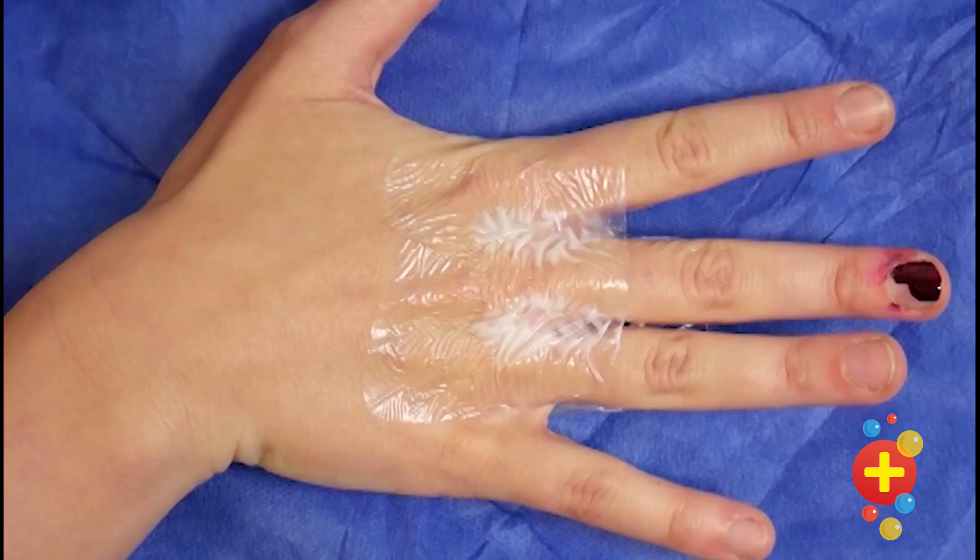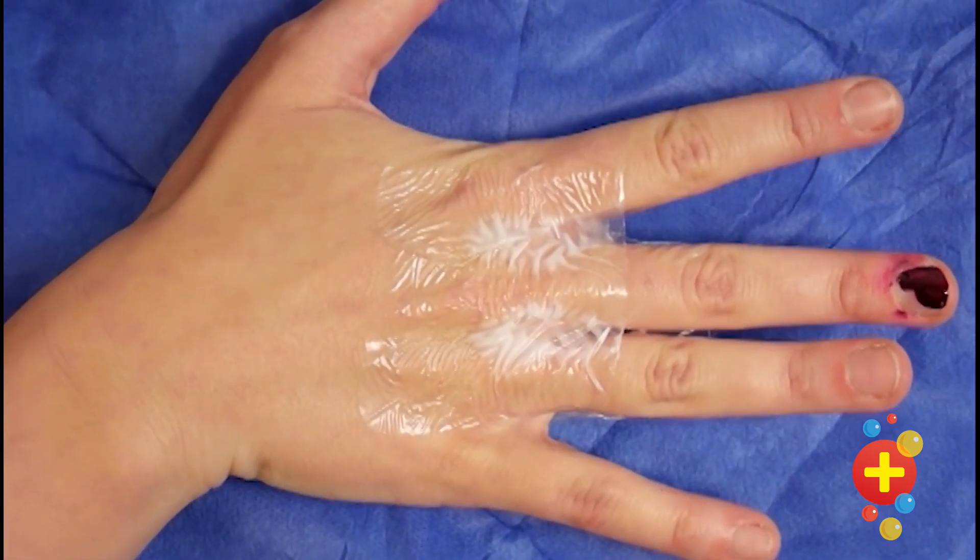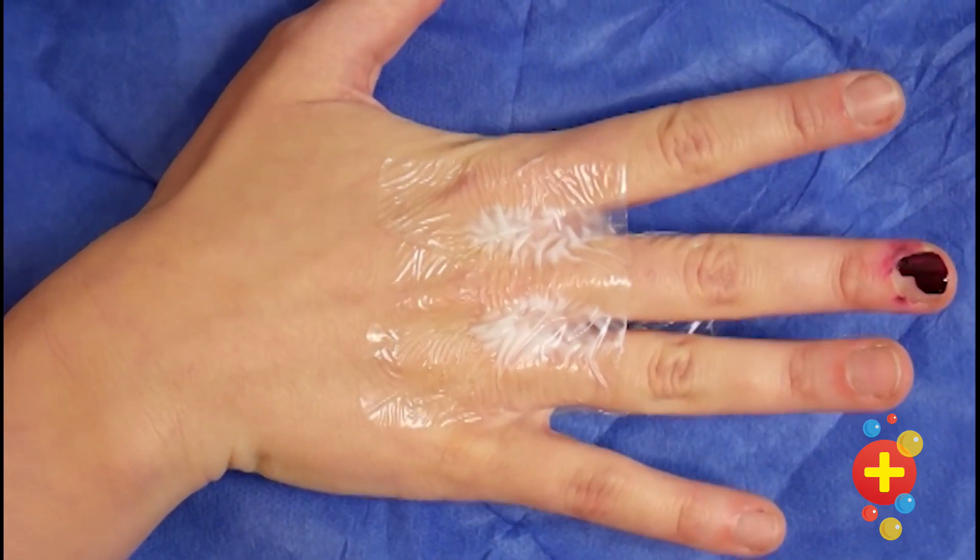We have a series of videos on common practical procedures in the children's emergency department, so I hope you enjoy. In this video we'll be showing you how to perform a digital nerve block. We'll show you the two injection finger web approach and a single injection approach into the flexor tendon sheath.